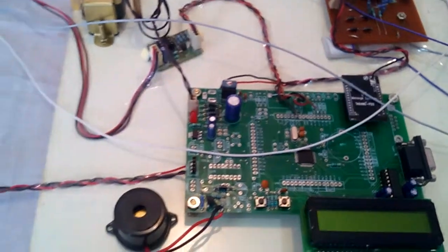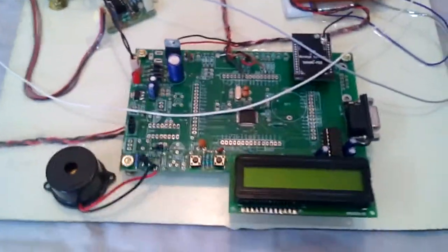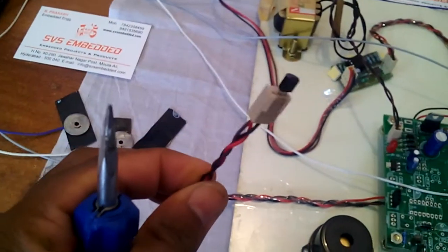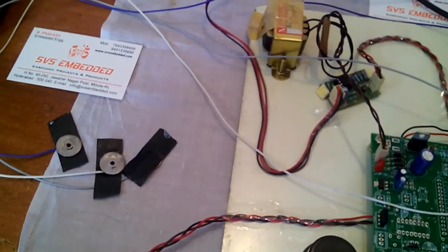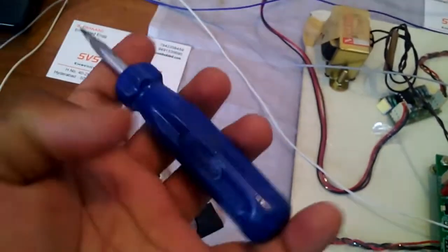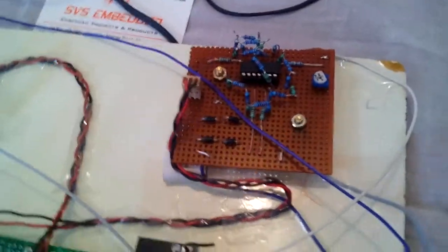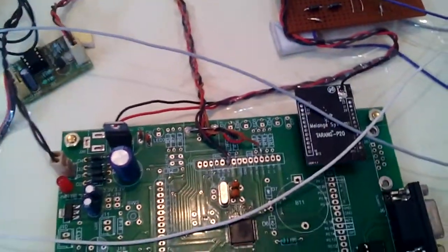I am using an LM1117 fixed 3.3V regulator. This development board has a buzzer alarming system and an LM35 temperature sensor, which has a range of minus 55 degrees centigrade to 150 degrees centigrade. The ECG electrodes — left hand, right hand, and right leg — are connected to the op-amp circuitry. It fetches the voltage levels in analog form, which is then converted to digital form in the ARM processor, and the digital value is displayed on the LCD and sent to the computer.